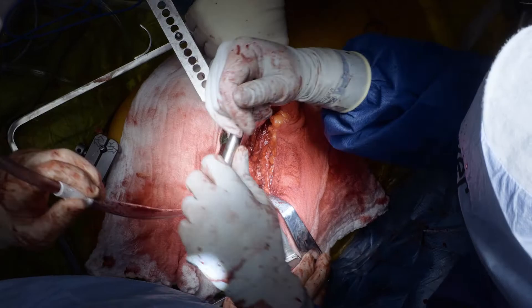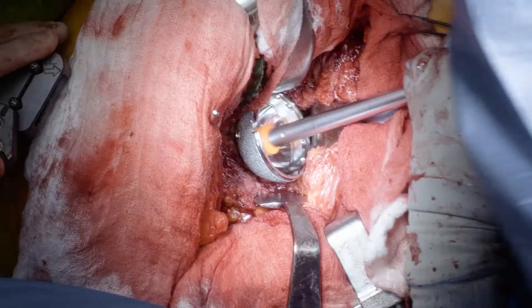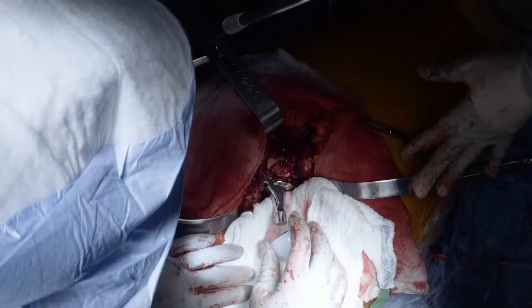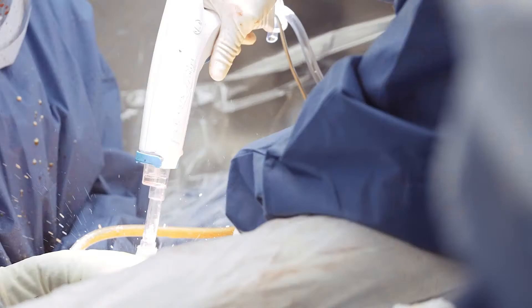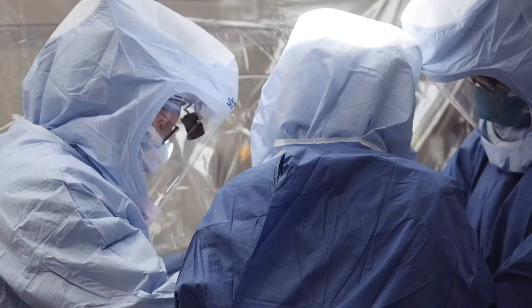So the game plan was to leave the femoral component, take the femoral head off, take out the acetabular component, and then revise that to a new acetabular component with a dual mobility bearing. The reason for the dual mobility is that revisions, unfortunately, have a fairly high dislocation rate, and this will give us a lot more stability in his hip.